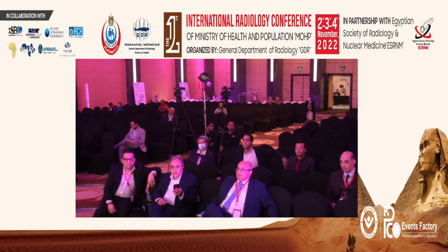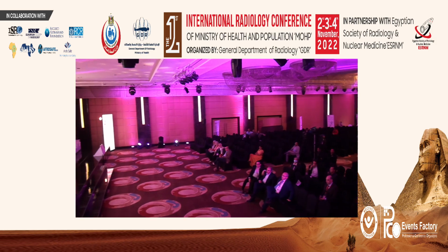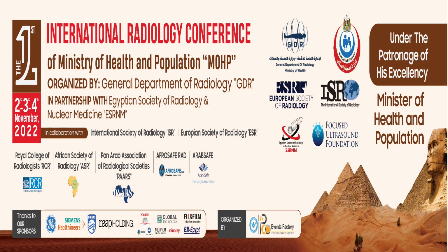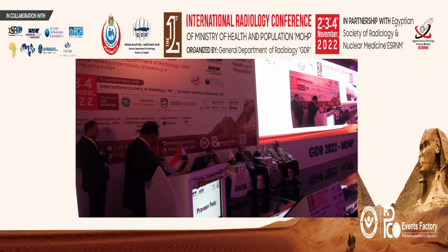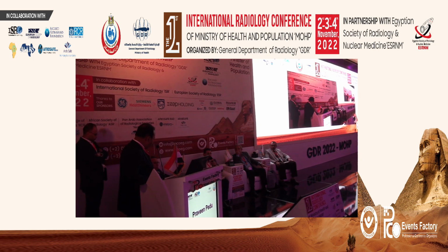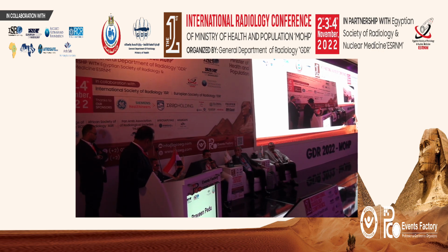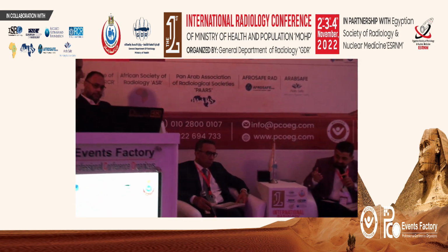Thank you for this very illustrative talk. If I want to comment on the IRE as a modality to add it in the scope of hepatobiliary intervention, I think, Professor Praveen and Amr and Professor Hassan, those patients who are not amenable to definitive radical resection or Whipple with a small lesion, we can add this tool to the scope of treatment of those patients. This is one thing.